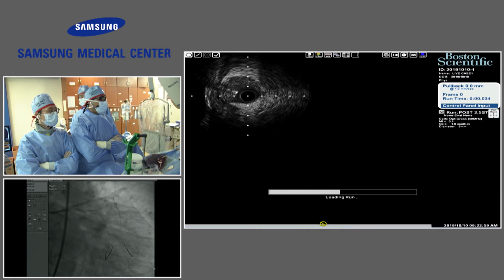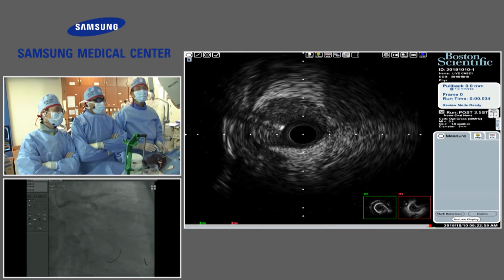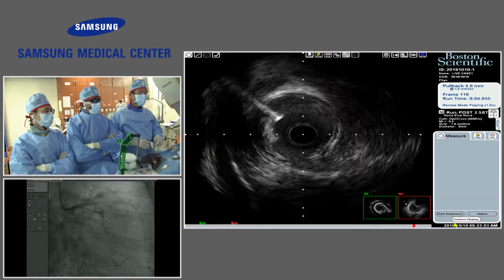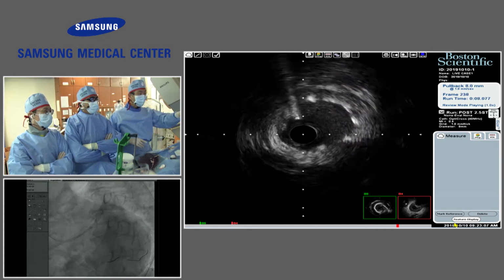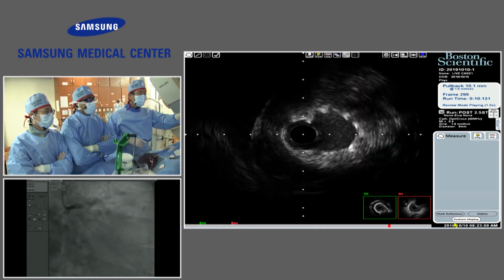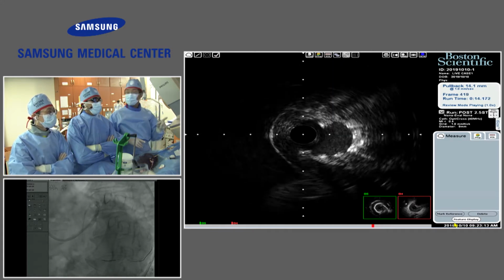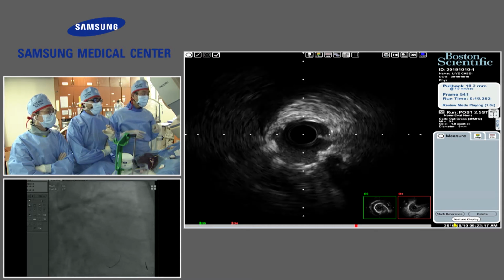And Professor Gwon, let's show them the angio after we used that strategy. Actually, I cannot find the angio, but then at some point we are sure that this is a stent, right? Yeah, the previous one, the last one we finished.